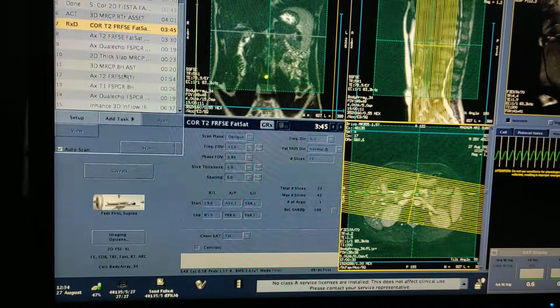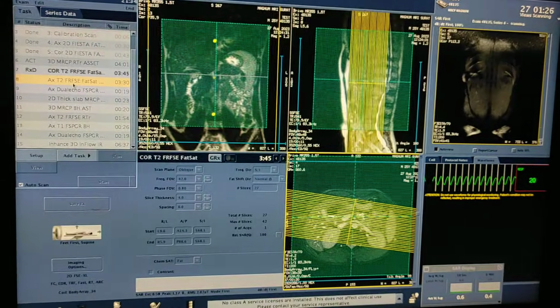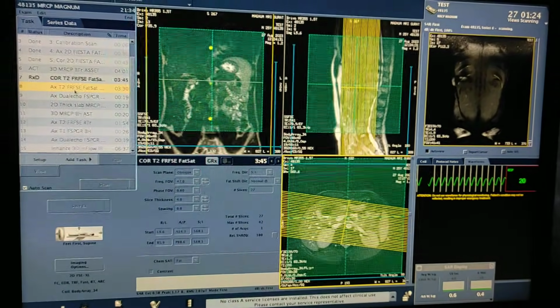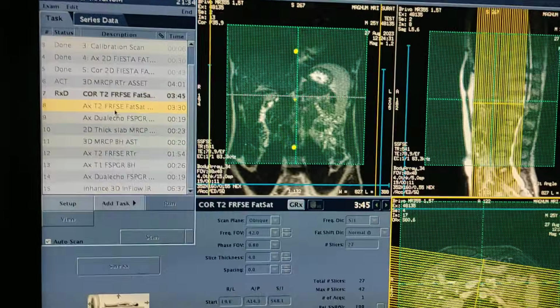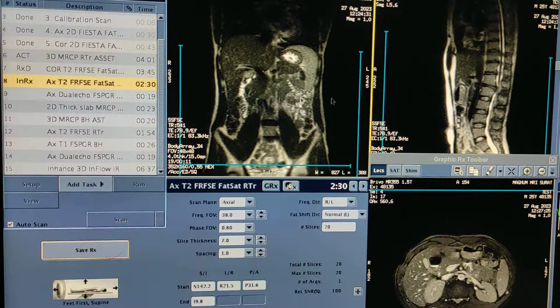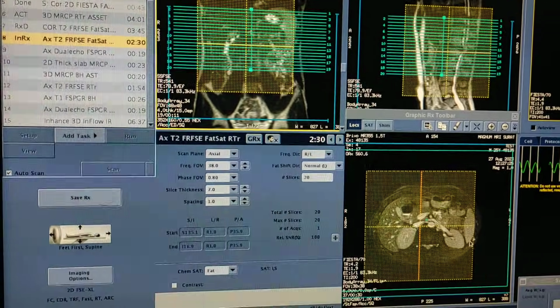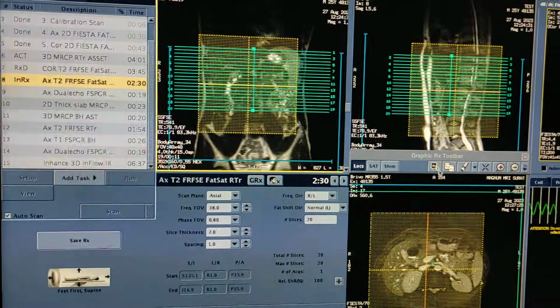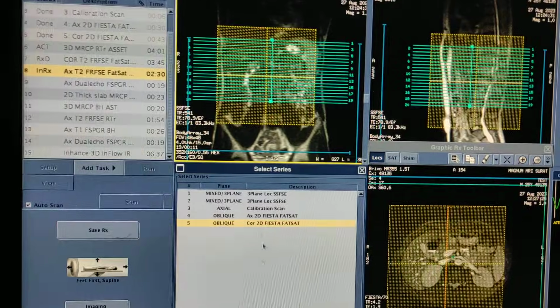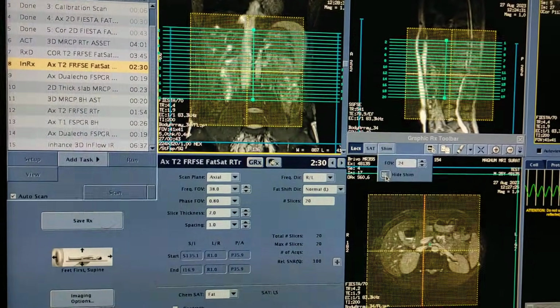Now I will show you the planning for axial fat set T2 after getting a 3D sequence. How much area you have to cover, I will show you on that. Now double click on axials. You have to plan axials on coronal. Click on this coronal sequence. I am having the coronal Fiesta over here. I will enter in the coronal box. Close the shim.